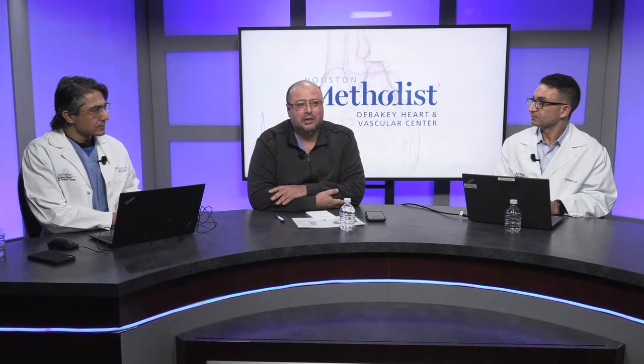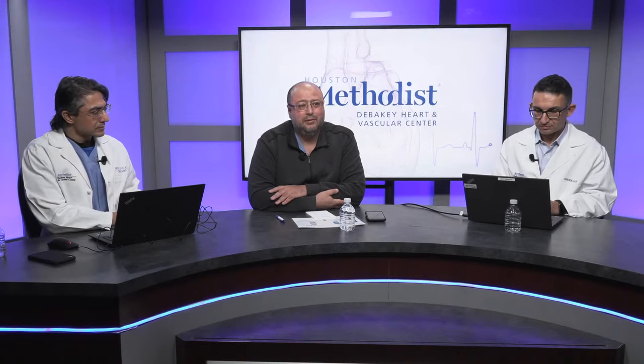Thank you, Dr. Nabi. Yeah, exactly. And what do you think of the regional flow, that the peak myocardial blood flow didn't reach 2 in the circumflex? Yeah, so as we were saying, it looks like there is a lesion in the circumflex, and even though we don't see calcification there, it is very convincing that this is a circumflex territory. It's a lateral wall. I mean, each patient is different.